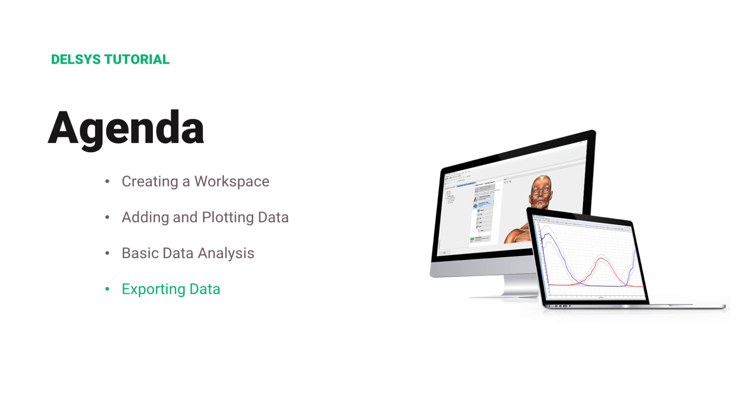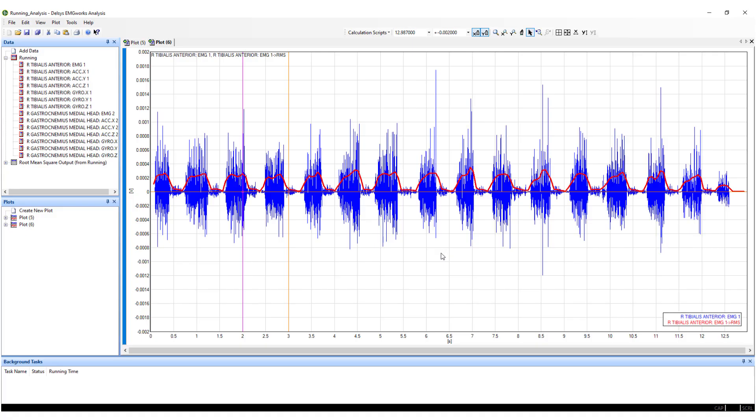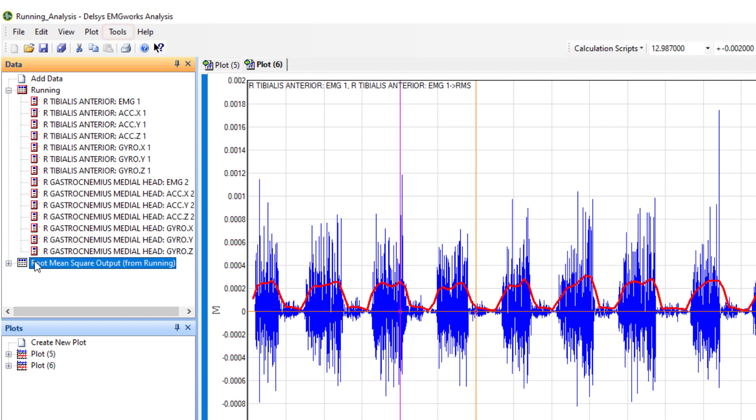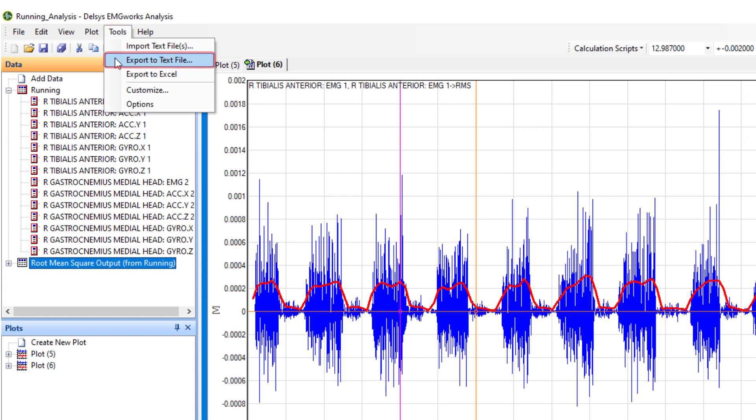Data files and calculations can now be exported from EMG Works Analysis. To export data from the trial, select a data file. Navigate to the Tools dropdown and select Export to text file or Export to Excel, depending on your preference.